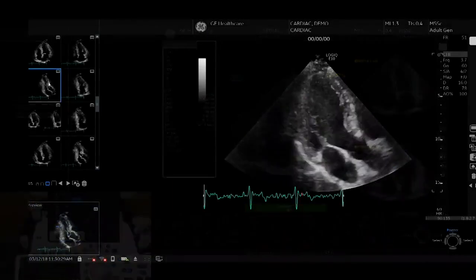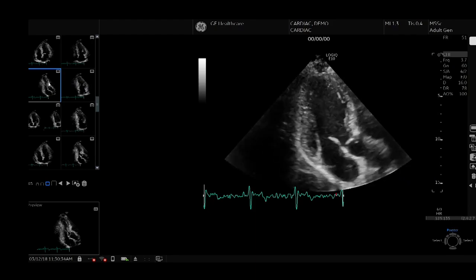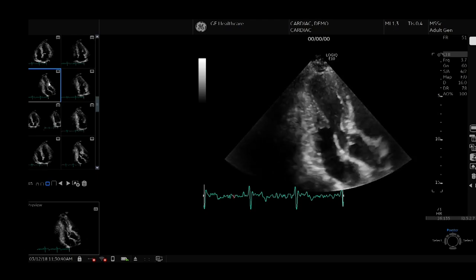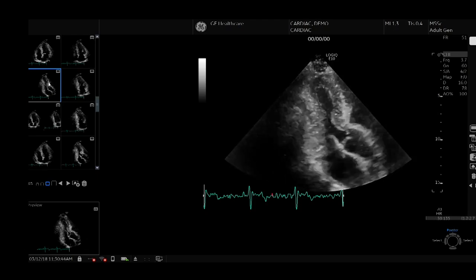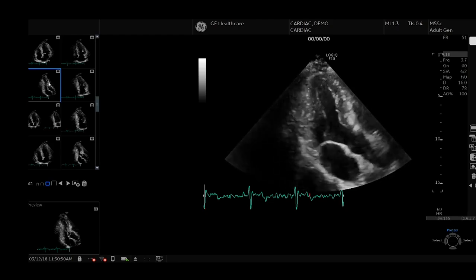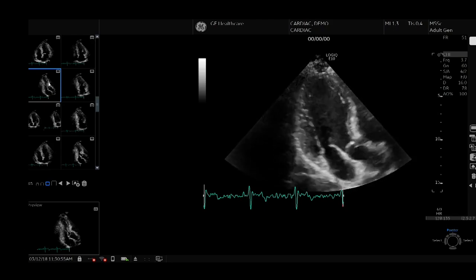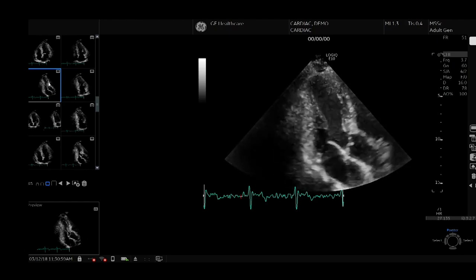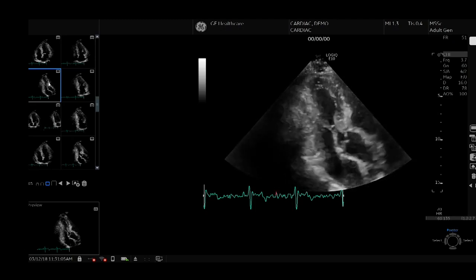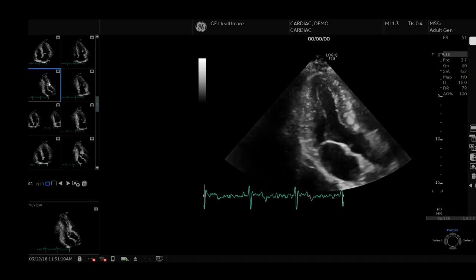Another comprehensive tool on the LOGIQ E10 for cardiac imaging is cardiac strain, automated 2D speckle tracking to measure the deformation or strain of the myocardium in real time to assist clinicians in early identification of underlying cardiac disease and aiding, diagnosing, and managing patients with cardiomyopathy. You'll achieve fast, accurate results with a quality indicator notifying the operator of acceptable data quality to support diagnostic confidence in the tracking results, and it's very simple to use. Just a few button pushes and the assessment is complete on the ultrasound system. There is no processing workstation required.